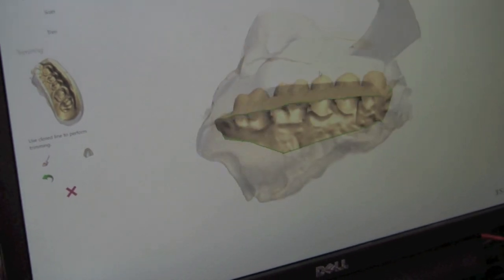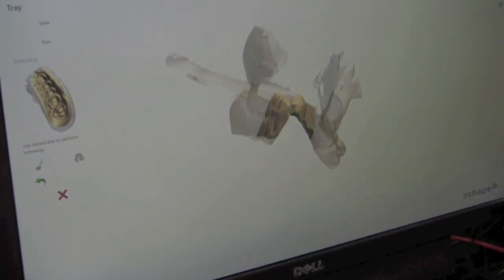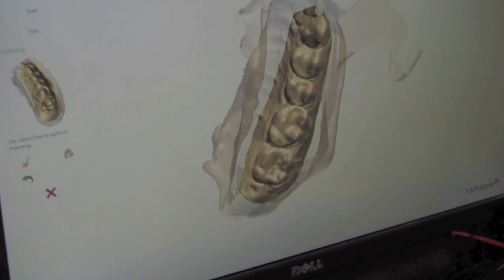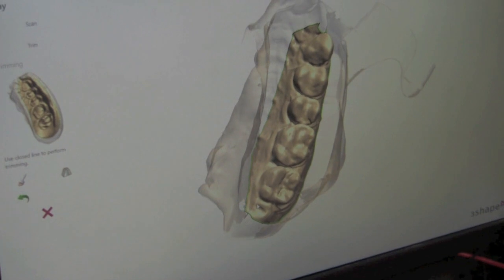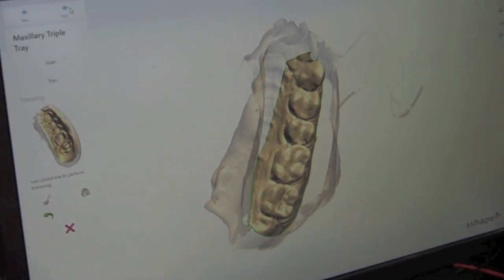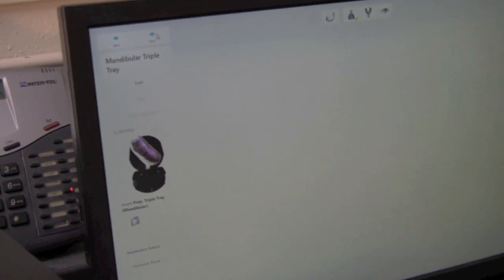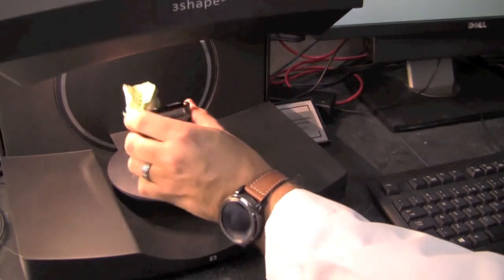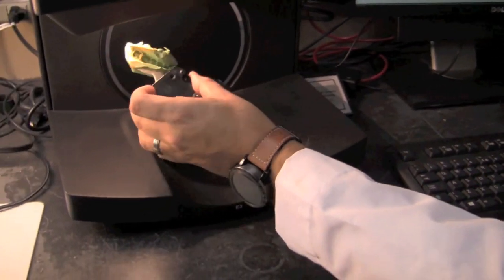You can see that it trimmed away all the excess and left us with our actual model. Once you're happy with the way that it's trimmed, you'll select Next at the top left. Now we're going to come back to our scanner and we're just going to flip over the impression tray inside the clamp.